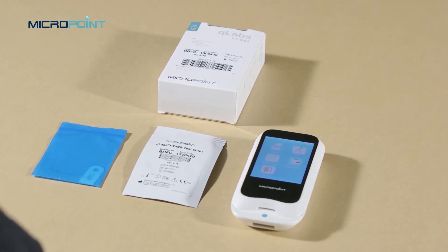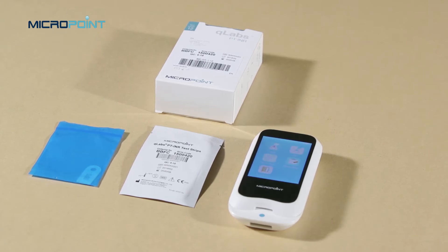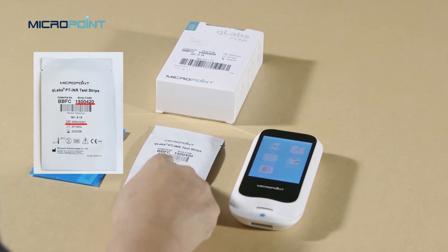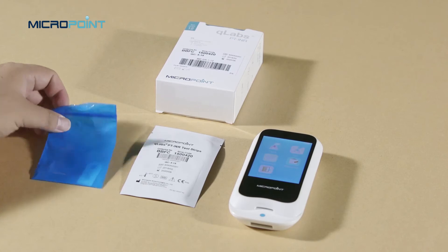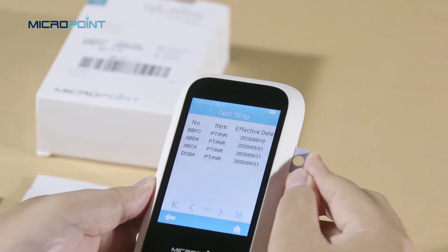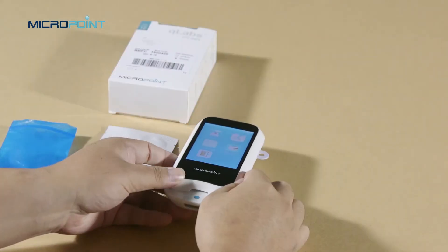Do not forget to use the test strip code chip that is supplied with each pack of test strips before you perform the first test with these strips. The code chip provides the meter with important information it needs to perform the coagulation test. The chip contains information about the test strip code, the lot number, and the expiration date. The code chip is required whenever a new test strip lot is used so that the meter can read and store the lot information about that particular lot of test strips.